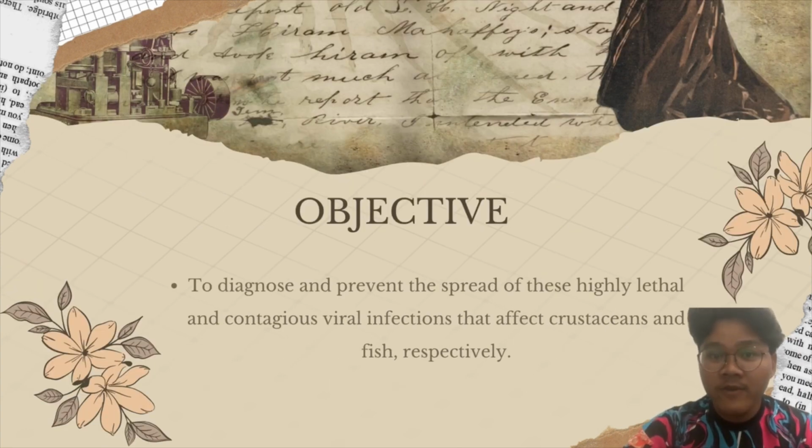For the objective, to diagnose and prevent the spread of these highly lethal and contagious viral infections that affect crustaceans and fish, respectively.